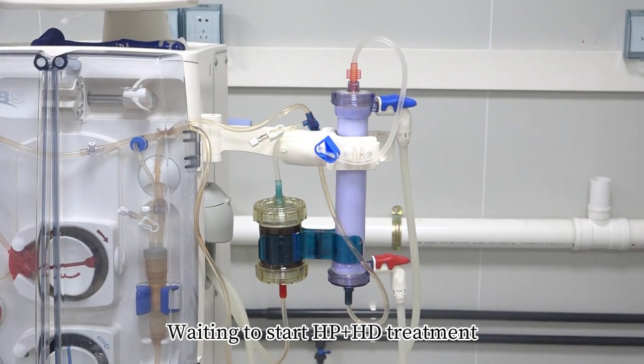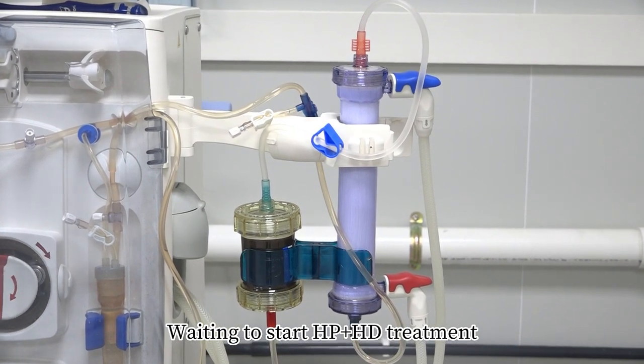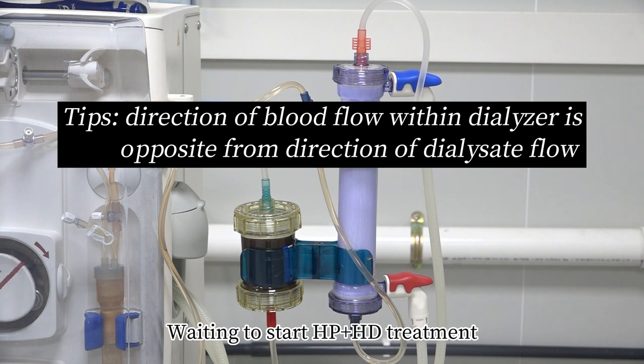Waiting to start HP plus HD treatment. Tip: Direction of blood flow within dialyzer is opposite to direction of dialysate flow.